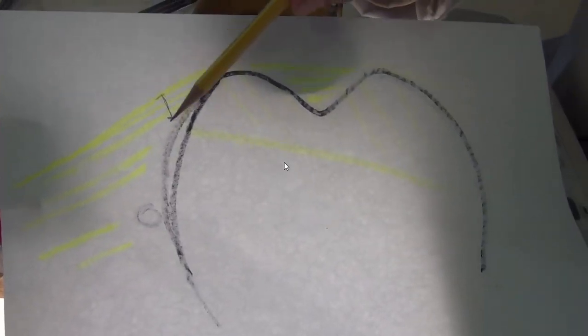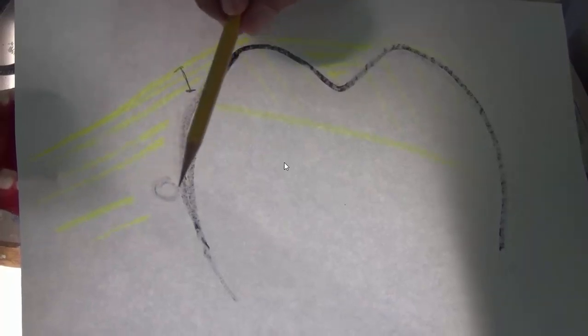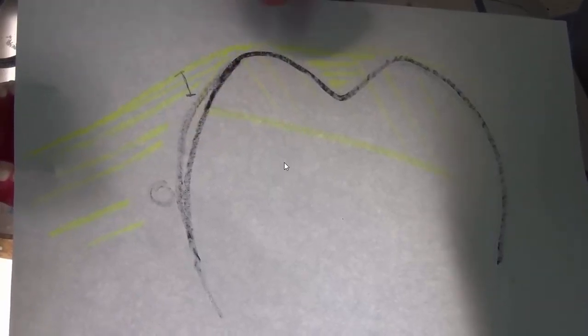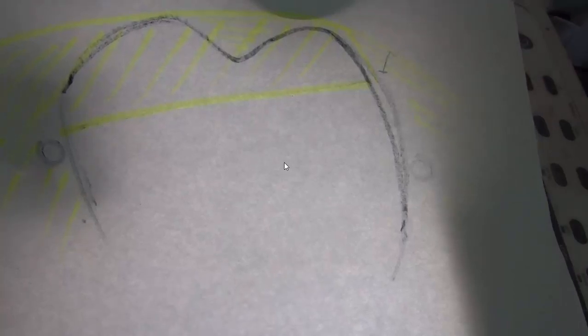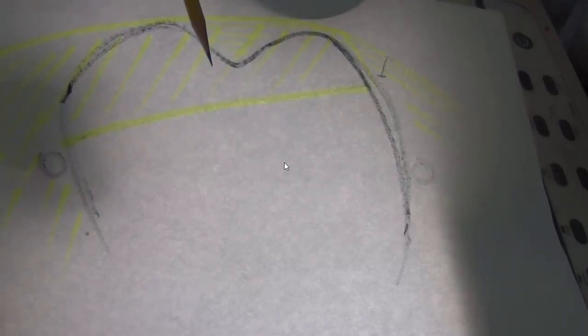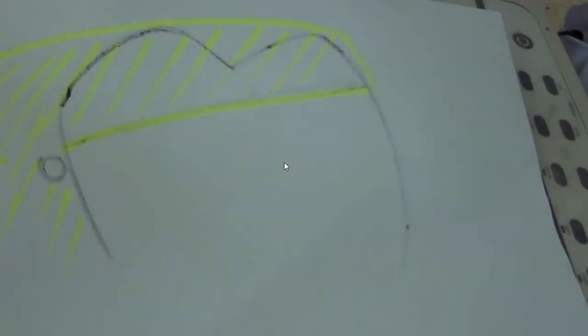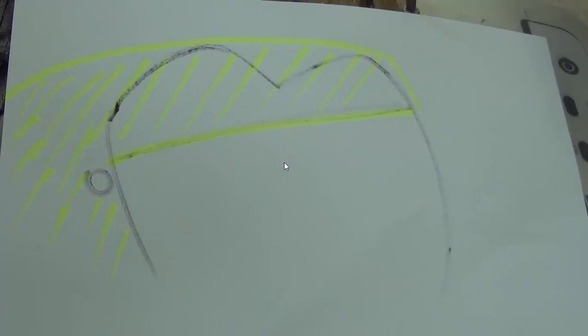So I don't want these small areas of plaster to fracture off because they are thin. They are like a flush, okay? Although the wire is embedded in this plaster, we have thin margins for this plaster. And we have an undercut here. So we will have this plaster fracture during dewaxing. We don't want this. Instead, before putting the tooth into plaster, we cut this off in a buccal inclination. So we will have a good layer of plaster over it, and it will be thick, okay? And it will withstand the pressure or the forces during dewaxing, okay? This is why we cut the teeth off.